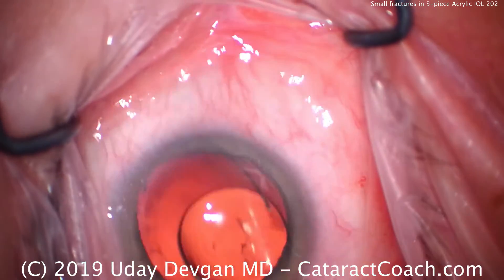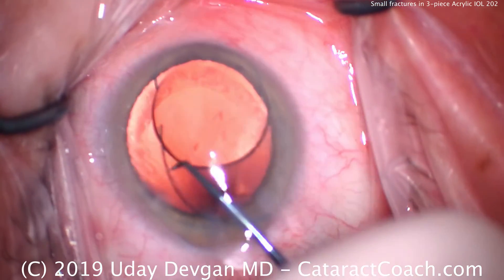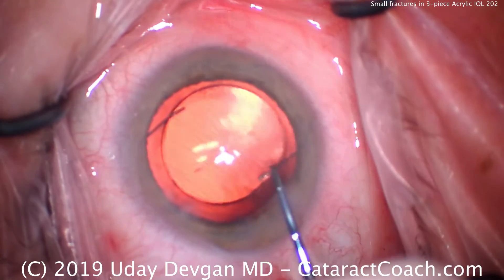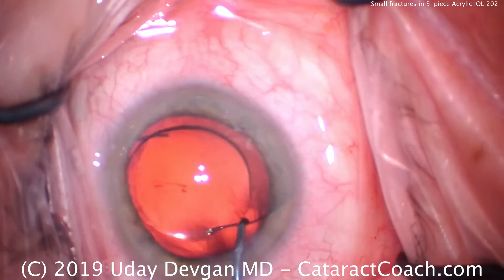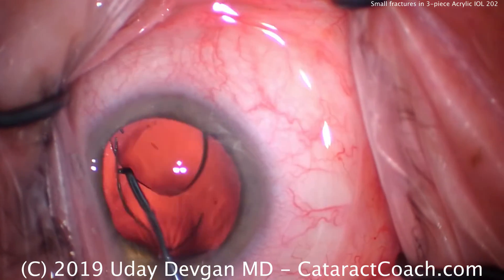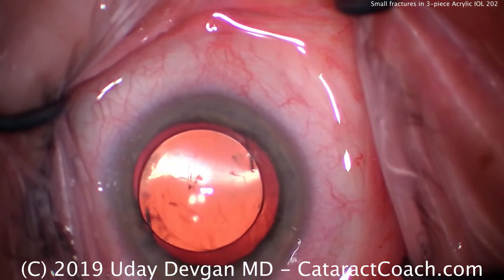Haptics are confirmed to be in the correct anti-S configuration. Let's dial in the haptics nice and easy. Here comes one haptic — rotate the lens around. Let's get the second haptic. The second haptic is on top of the eye, so we don't want that. Let's rotate it again, and we've got to get the second haptic in the bag. Beautiful. The entire lens now is in the capsular bag behind the capsular edge, which overlaps it.